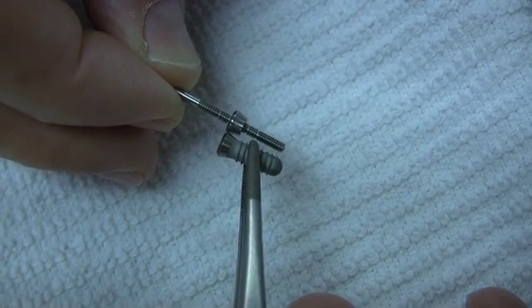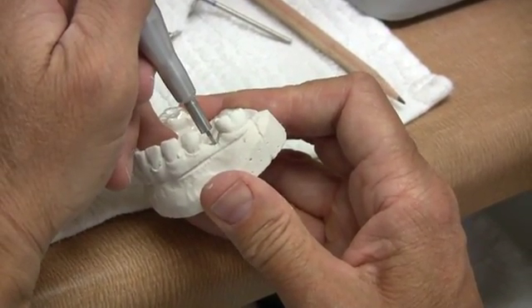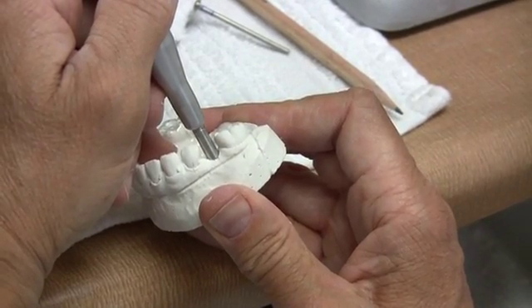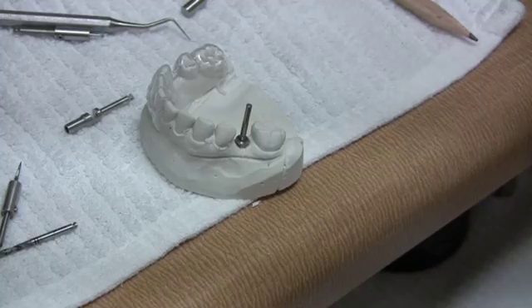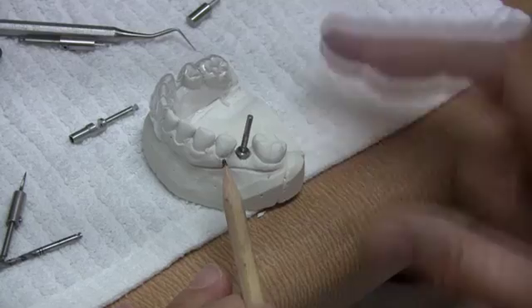So now let's go to a model demonstration. For this demonstration, let's assume we drill to a depth of 6mm with a 2.2mm drill. We can then set the platform to the 6mm mark and insert the gauge.